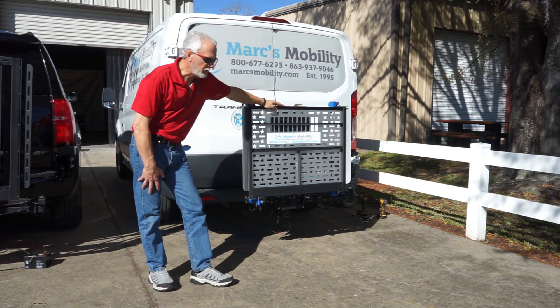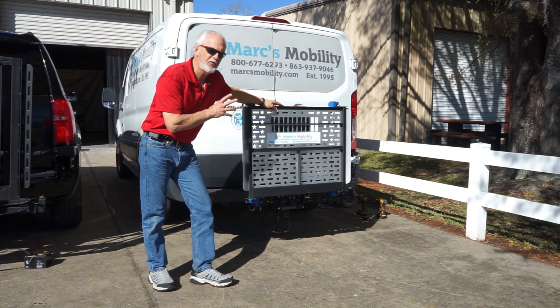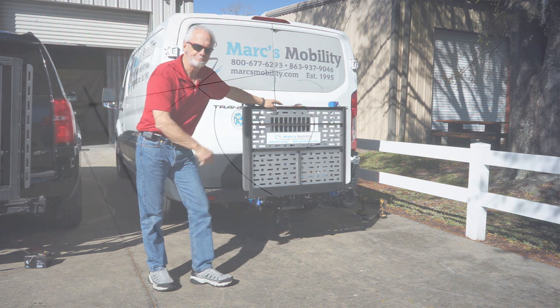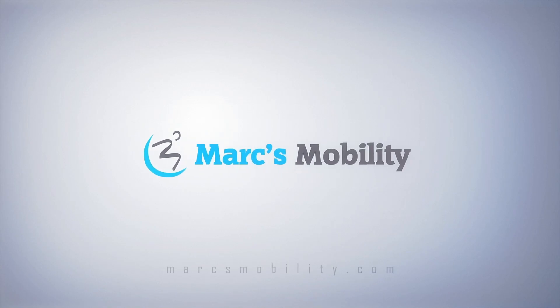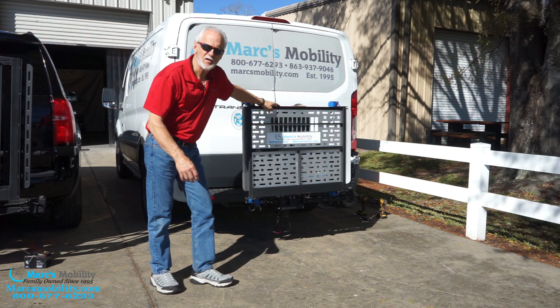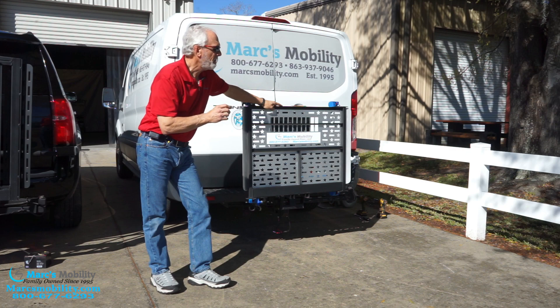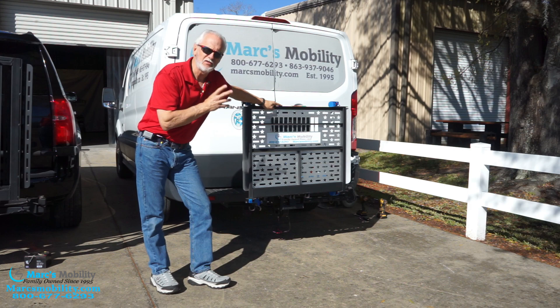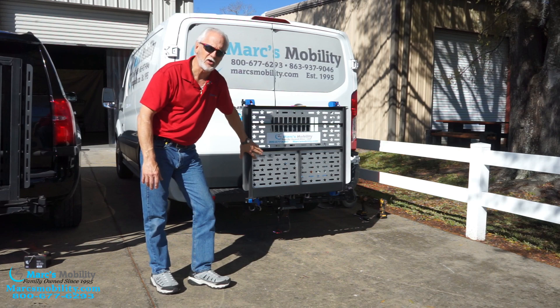Good afternoon folks, this is Mark with Mark's Mobility. We're doing a review and demonstration today on the Harmar AL500 lift for power wheelchairs — not for scooters, this is for power wheelchairs. This is the most popular lift in America, and one of the most popular lifts out there today. You'll see a lot of these behind cars.